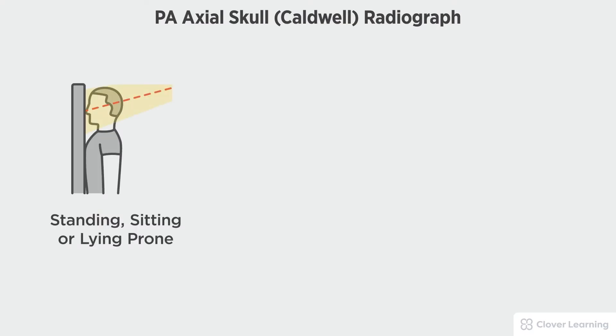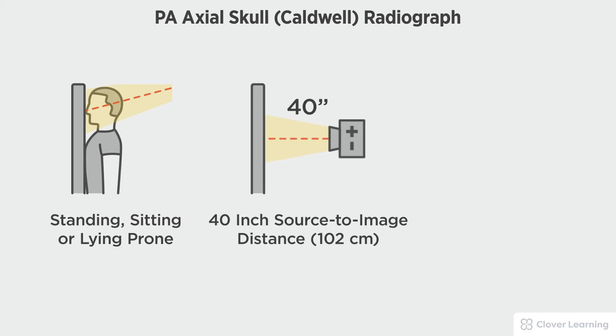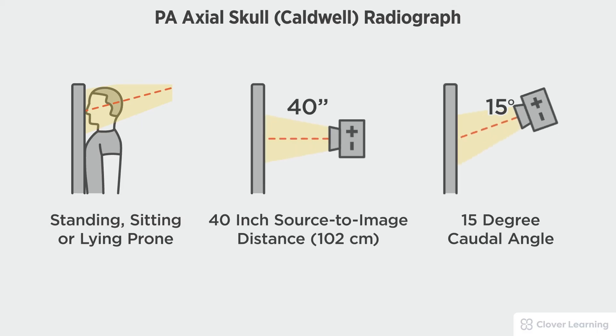In this view we will be demonstrating the PA Axial Skull Caldwell view. The PA Axial Skull Caldwell view should be performed with the patient standing or sitting at the upright bucky or lying prone on the table with a 40-inch source to image distance and a 15-degree caudal tube angulation.